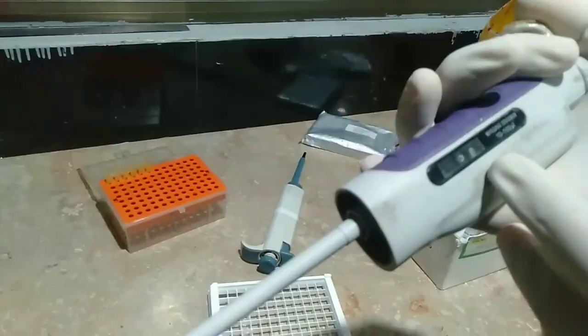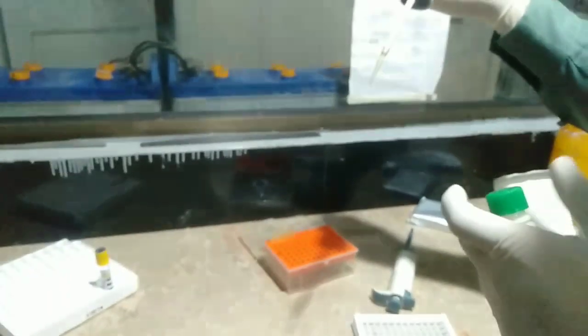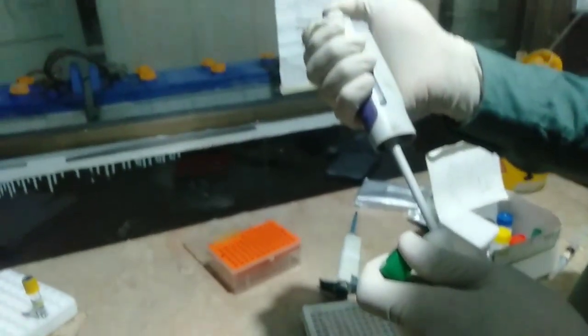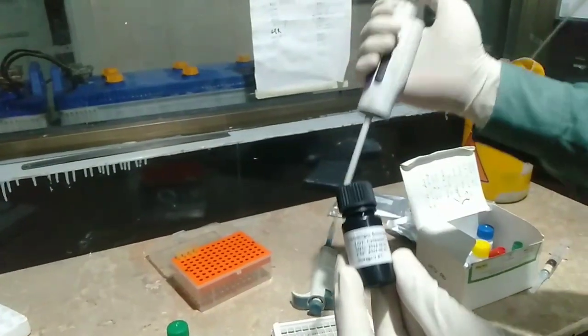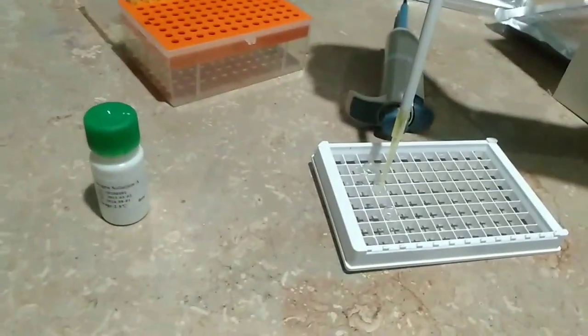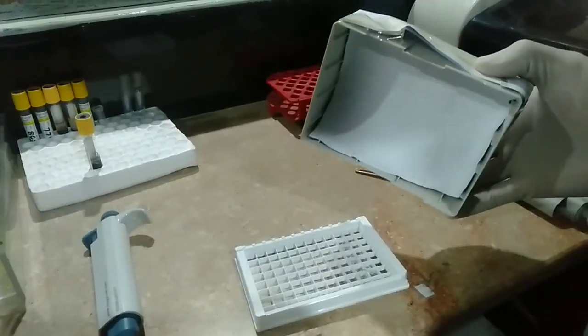After the second washing step, we add chromogen A solution — 50 microliters — into all three wells respectively, using a clean tip with the pipette set to 50 microliters. Then we add chromogen B solution, which is also called TMB solution, into all three wells respectively.